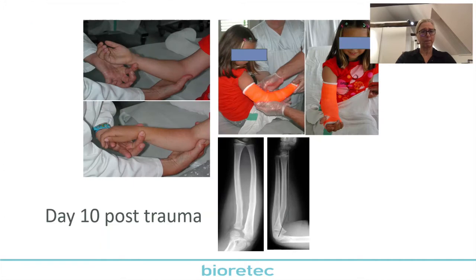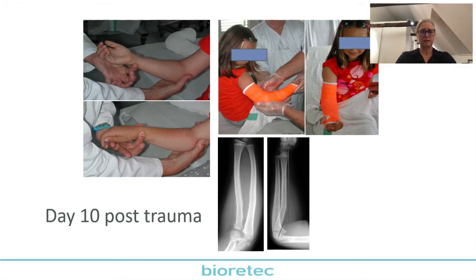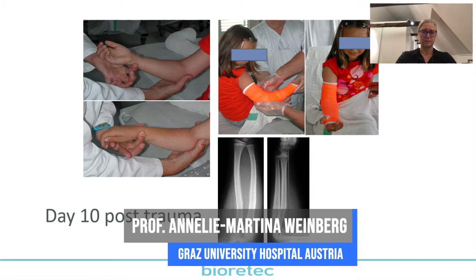If you see here a really slight deviation proximal, and you are not sure whether this makes any problems or not: it's a greenstick fracture, typical in this age. It's a 5-year-old girl. What you can do 7 to 10 days after the trauma is test it. It's important that you fix the epicondyle. This is always important when you check the movement of the forearm. You fix the epicondyle, and then you turn around. You don't have to stress it to the maximum, but if you can overcome the neutral position, then it makes no restriction. Next.